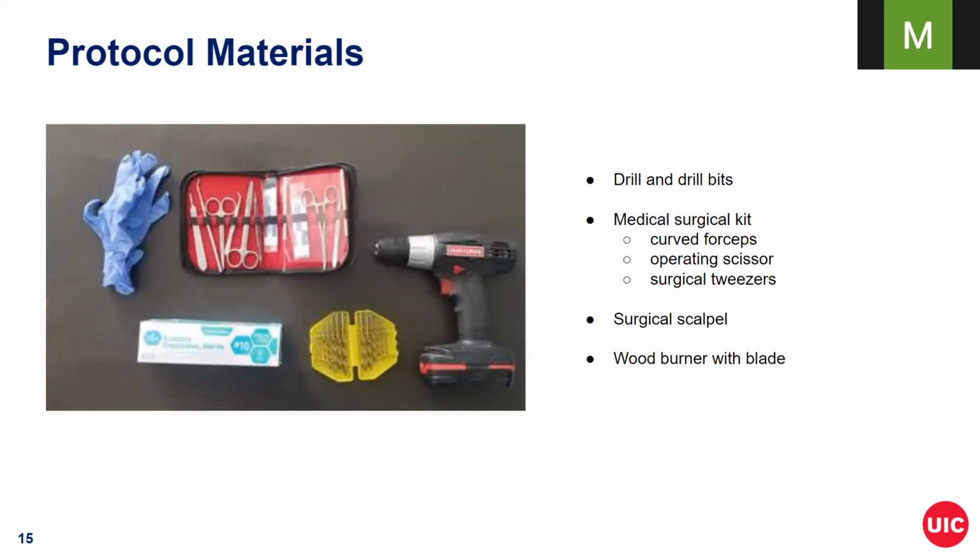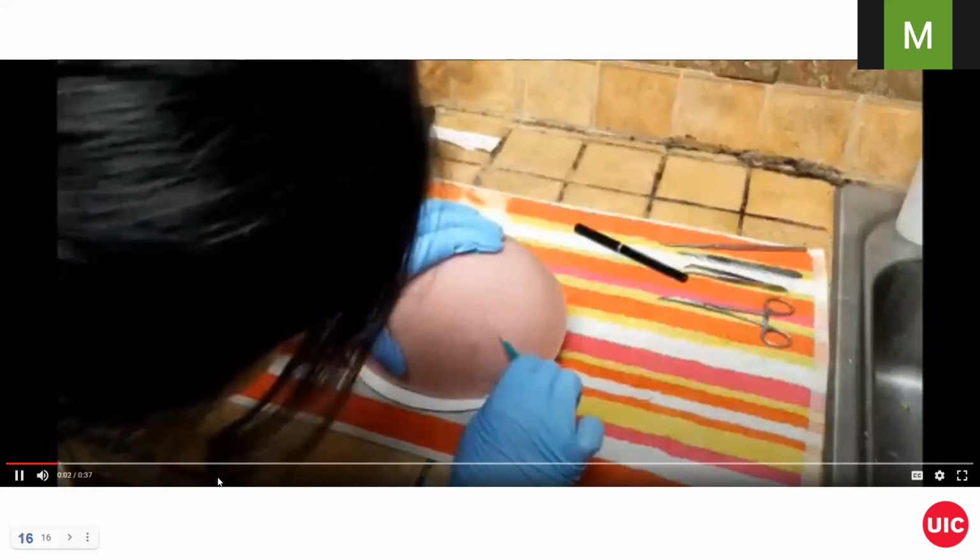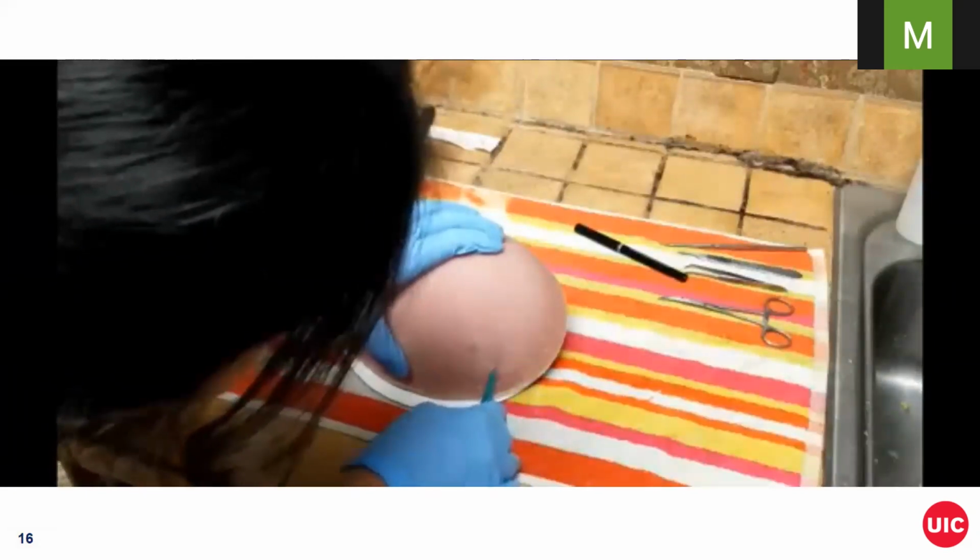For our own protocol, we used drill bits, medical surgical kit, a surgical scalpel, and a wood burner with a blade. We began the procedure by cutting a circular pattern around the prospective tumor placement.